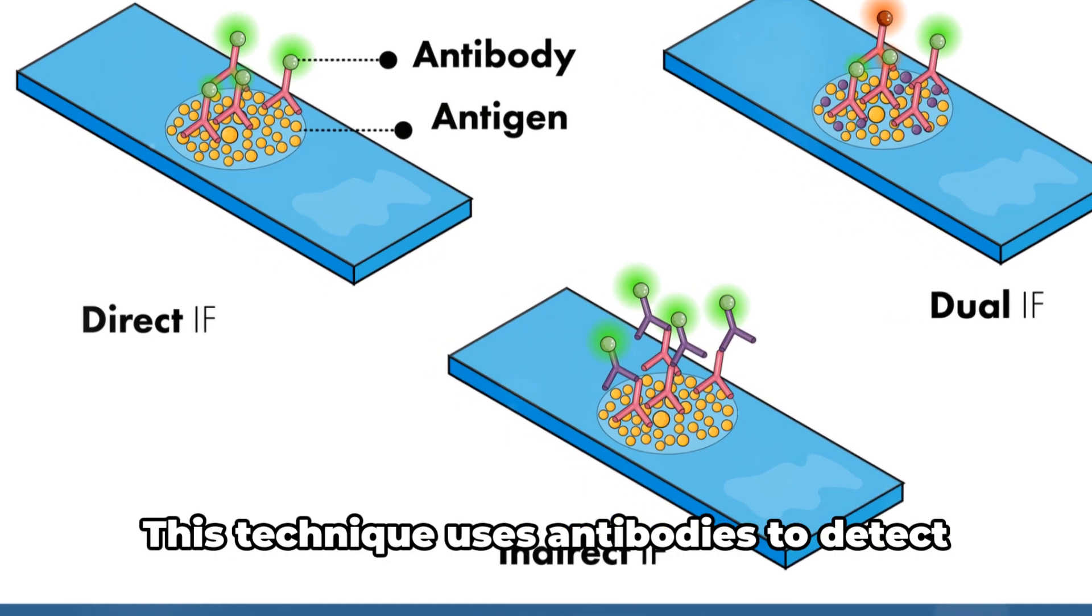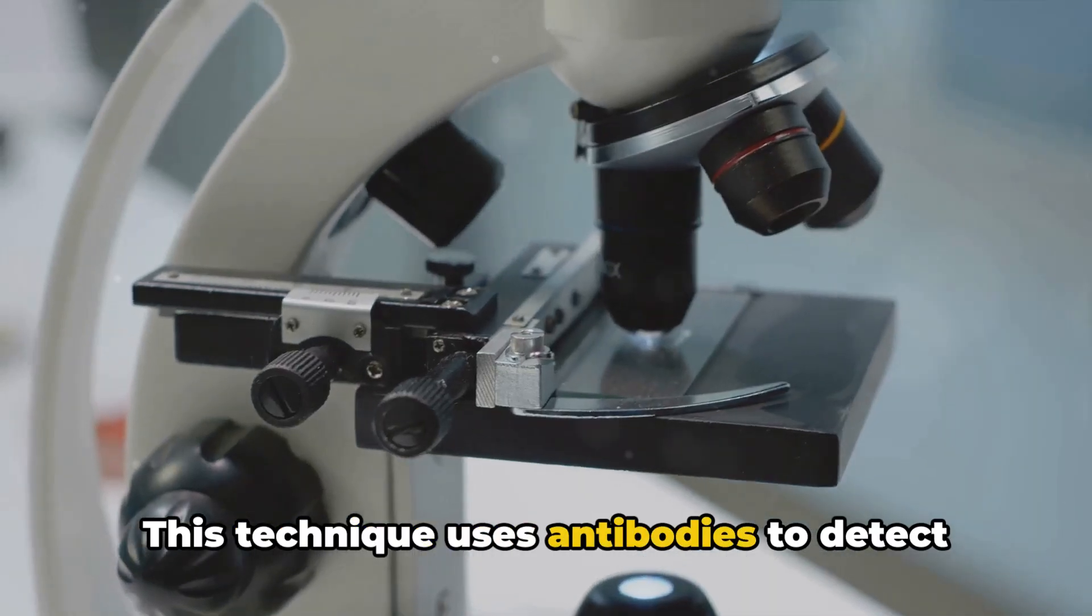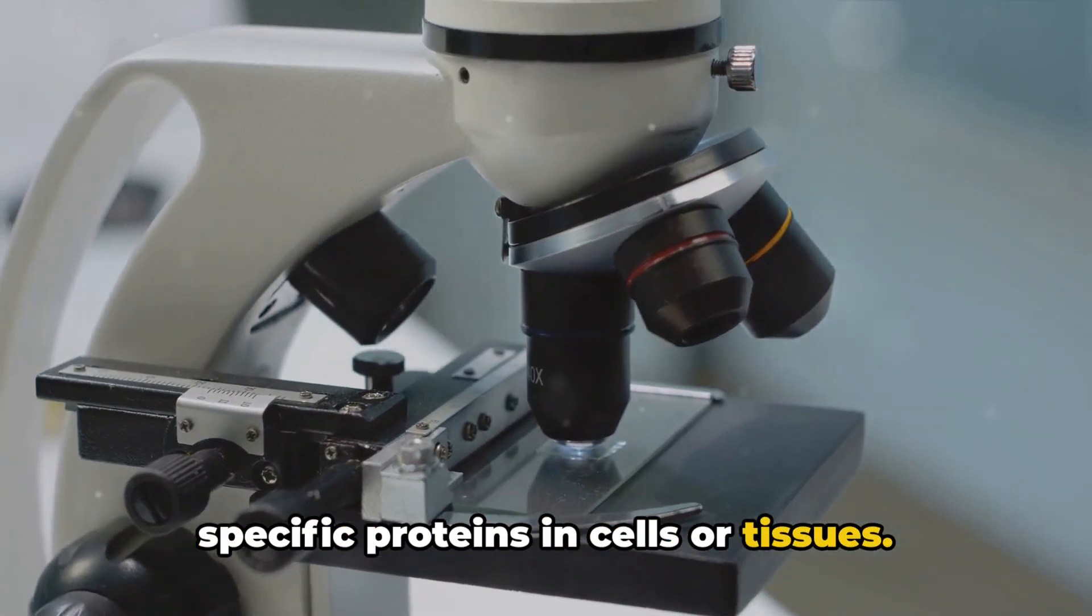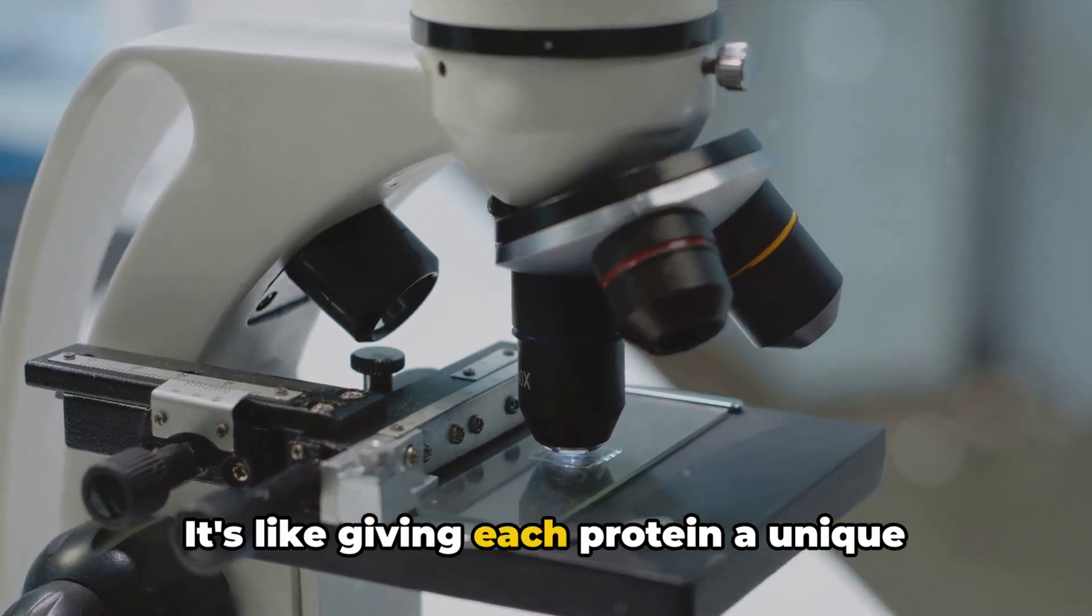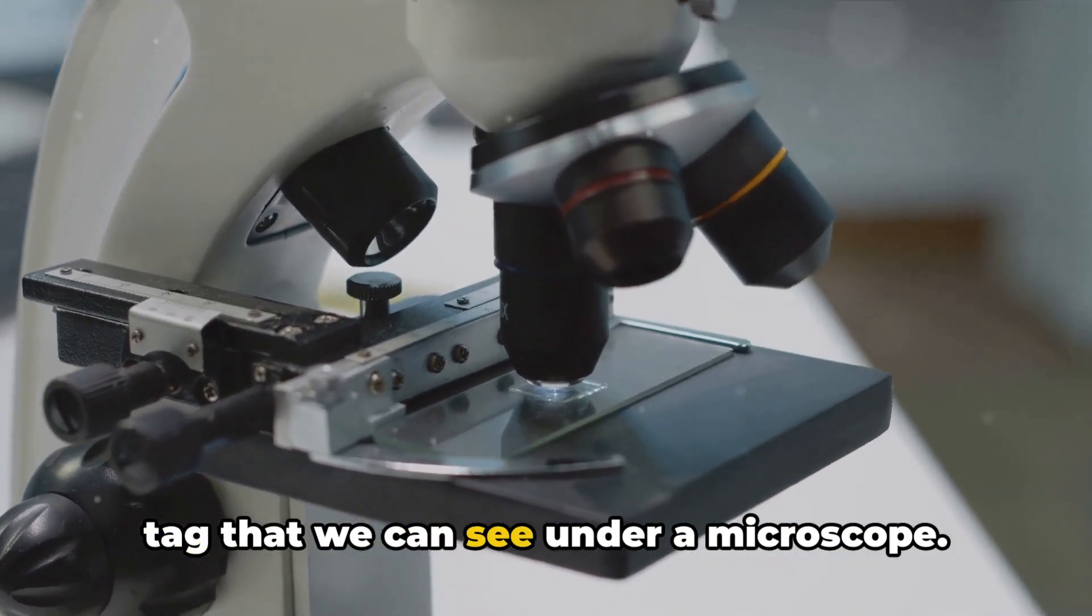Then we have immunohistochemistry. This technique uses antibodies to detect specific proteins in cells or tissues. It's like giving each protein a unique tag that we can see under a microscope.